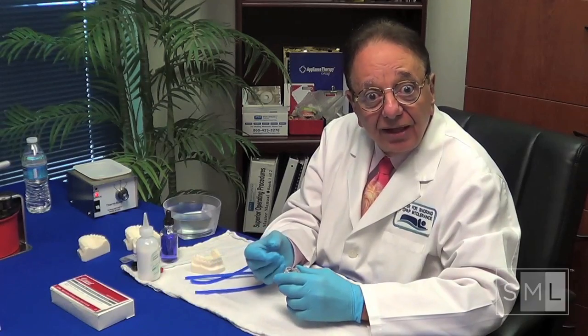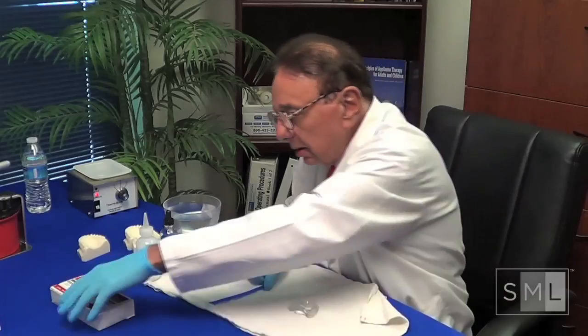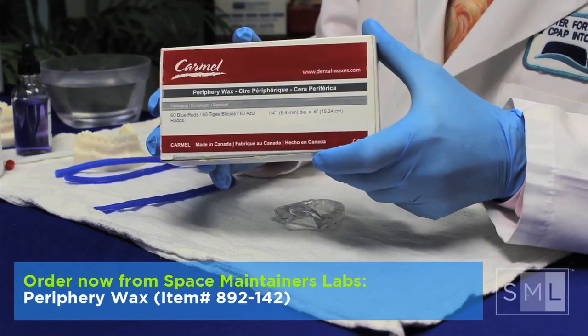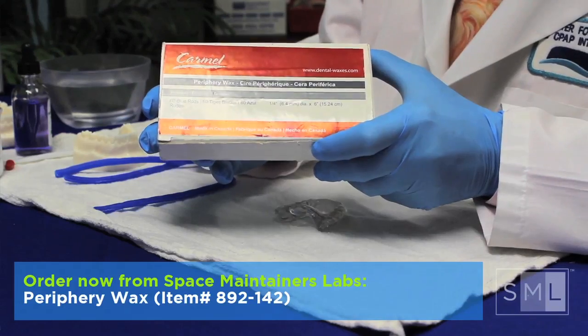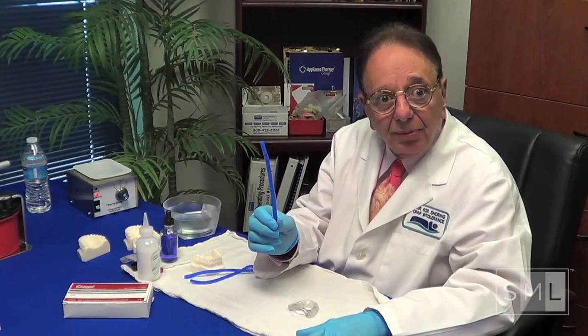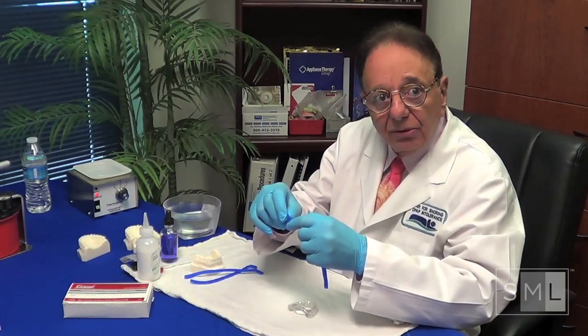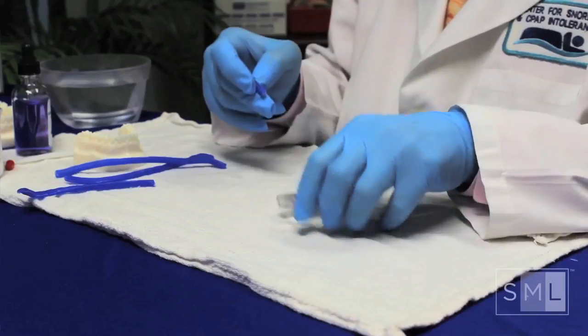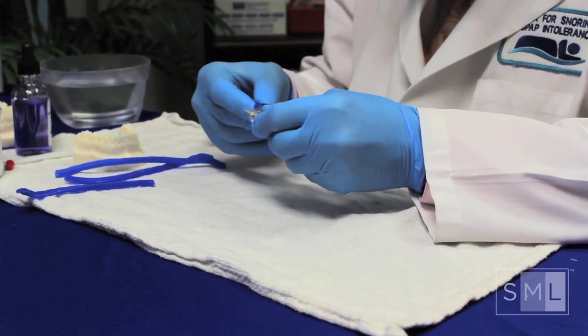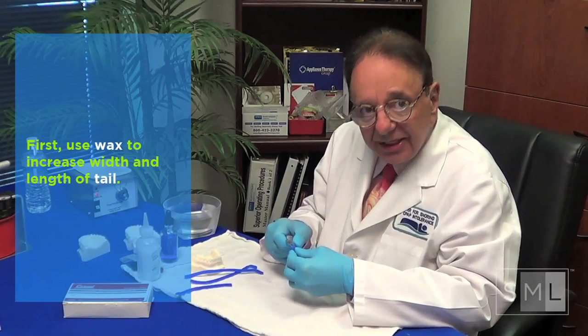We're going to be smart. We're going to add wax first, because by putting what we want on with wax, if they're uncomfortable, we know we can take it off easily or even cut the wax in half. We use periphery wax — there are numerous brands on the market. You can go to any dental supply company and get periphery wax. This is what you put around an impression tray to extend it. I'm going to take a small amount and put it right here on the tail.